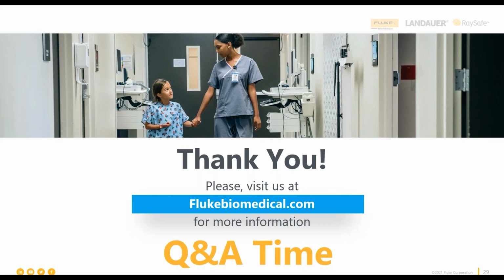Is the REM connection common for all ESU devices, or is there a need to change by manufacturer? Yeah, so REM testing, I just want to hit on this again. REM is the same as CQM, is the same as ARM. There's lots of different names, but this is monitoring the return plate to make sure that there's a good connection with the patient. When that plate separates itself from the patient, the surface area of that return current reduces because less is in contact with the patient, and it creates a higher heat over a smaller area, and that's what causes burns. So we need that plate to have as much contact as possible to spread that current and heat out.